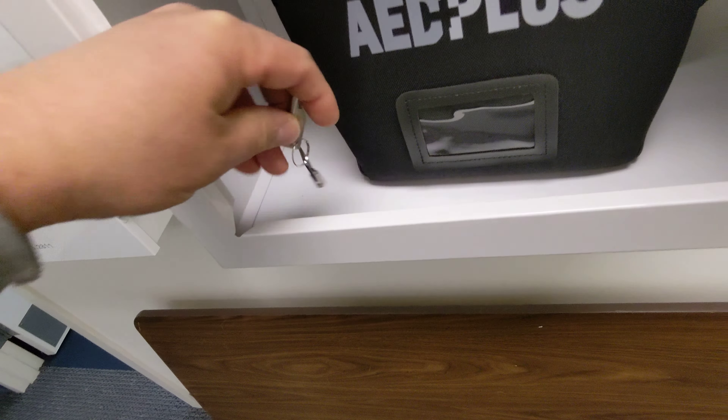So that's the little alarm pack. It basically works off of this door switch here. If I turn it off, then it beeps. But if I let it go, the beeping stops.